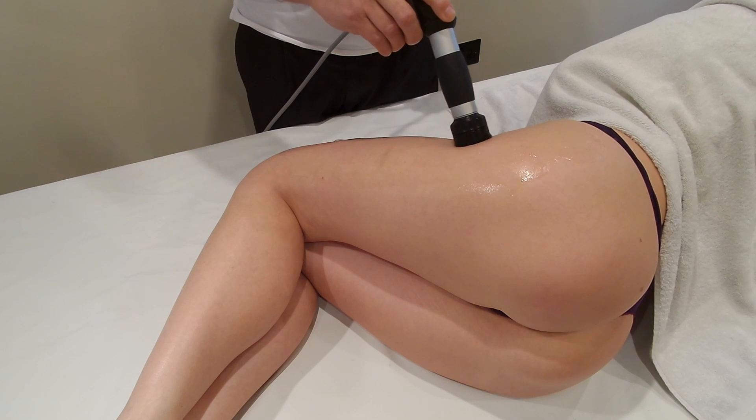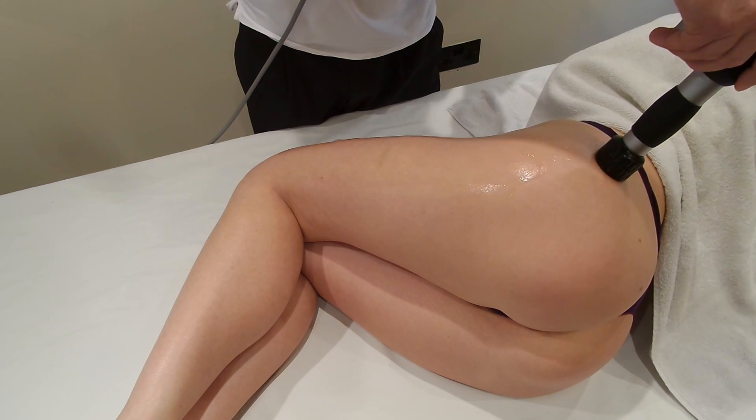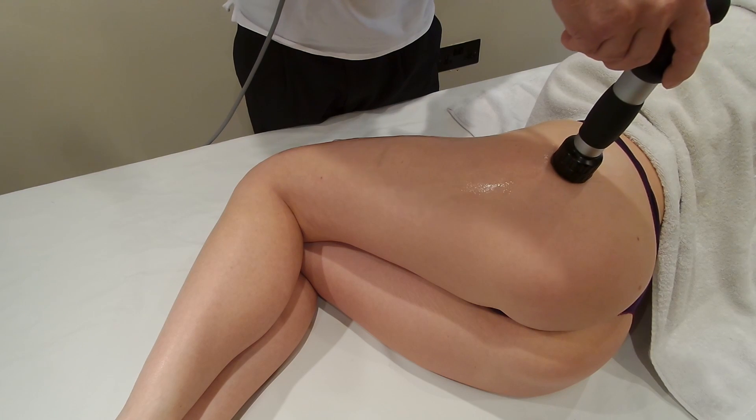As you can see here, just working our way up and down the iliotibial band, right across the top now, up towards the top of the hip, and back around again.